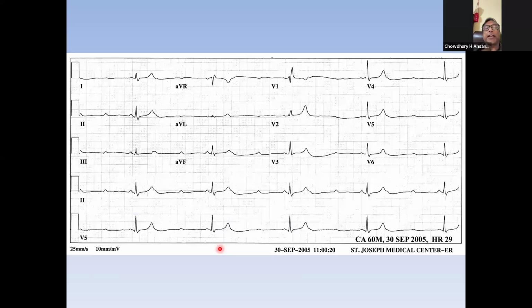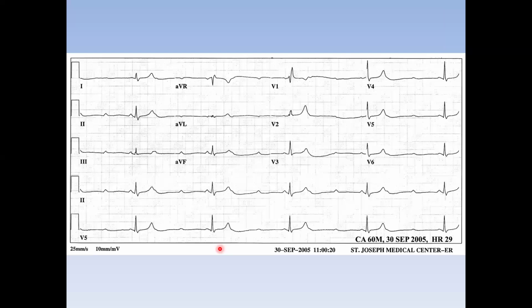And your other patient that showed junctional rhythm, pretty regular, we need to be careful whether the patient is on digoxin or not. Sure. So medication is something that we need to make sure of. Anybody coming with complete heart block in the setting of AFib or any other setting, we have to look at the medicine.